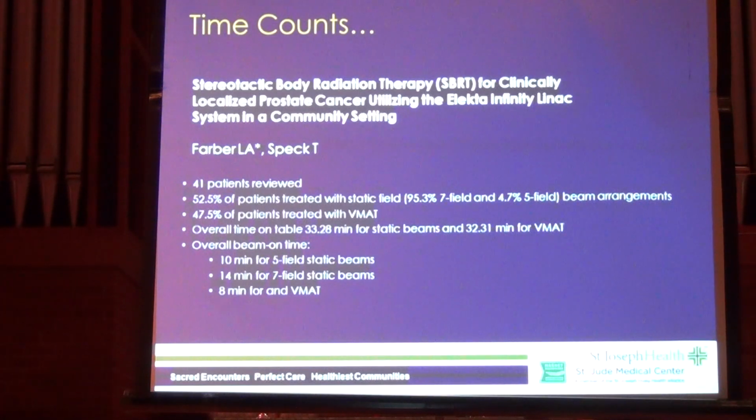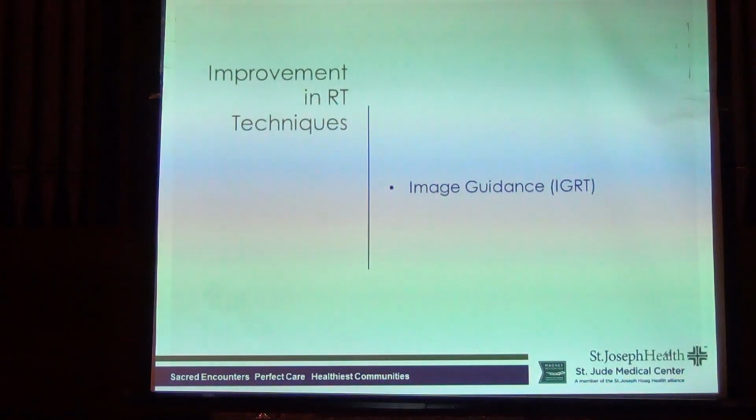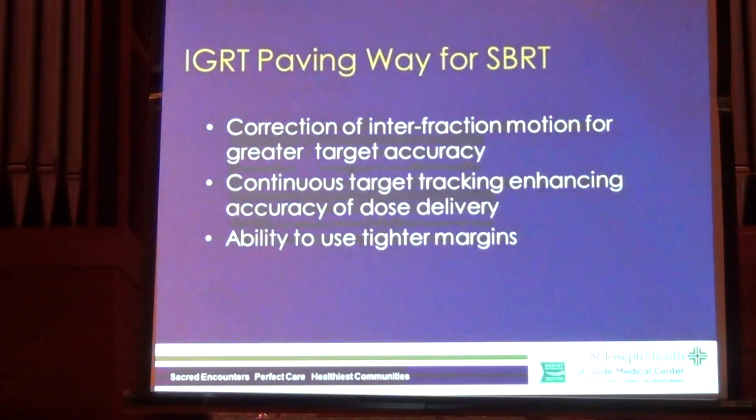It doesn't mean you're in the office 5 to 6 minutes. You're typically there for a half an hour to an hour to be in the prep position, but it's very fast under treatment. Again, improving our techniques. We do image guidance.